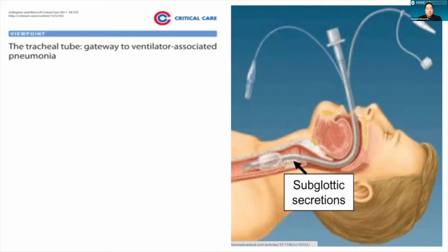We now know approximately 50% of intubated COVID patients contract ventilator-associated pneumonia due to the design of the breathing tube. However, this isn't a new problem. It's really a scourge of modern medicine, and the problem is getting worse due to increased antibiotic resistance. Let me explain.